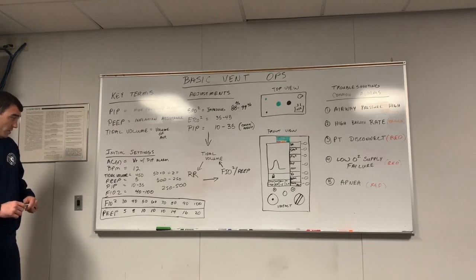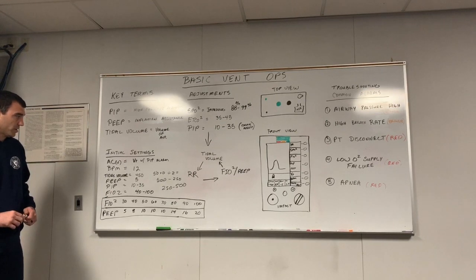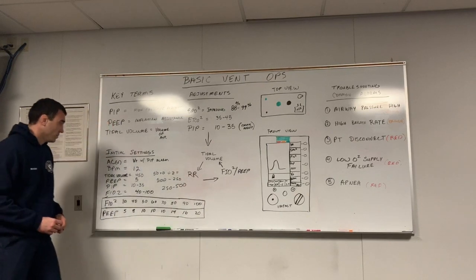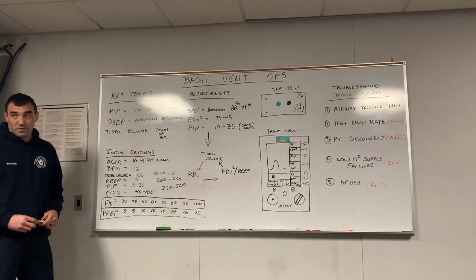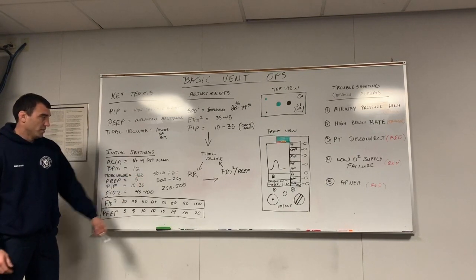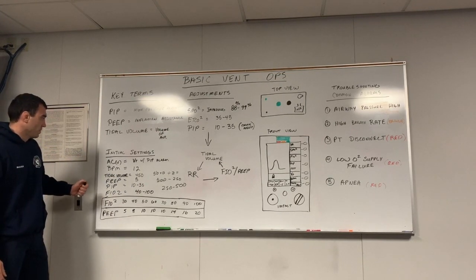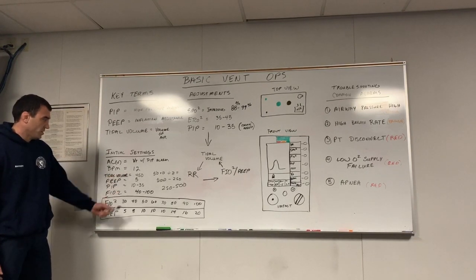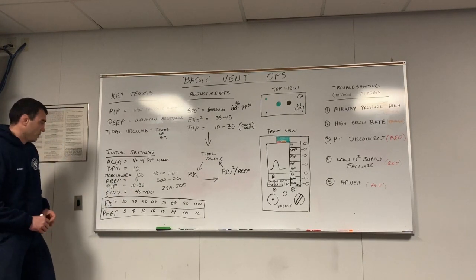Okay. I drew this chart here from ards.net, if you want to go in there and look it up and read more about it, talking about the relationship between FiO2 and PEEP. So what a lot of people do is they just turn it on and run with the default settings, right? We're going to assume our patient is 5 foot in the example I gave here, the average smaller elderly female. So we go with the default to 450, we leave all the default settings alone, and we put the vent on 100% of FiO2.